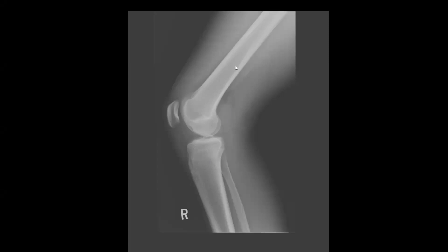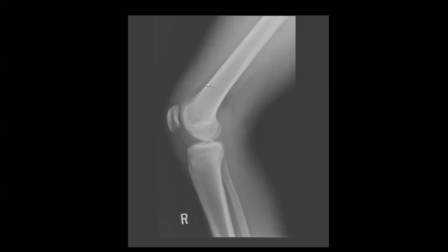If we take a look initially, we notice that there's no acute fracture or dislocation. The alignment of the knee looks intact. If you look at the relationship between the femur, the patella, and the tibia, everything looks great. There is, however, a small suprapatellar joint effusion. There's an increased density in this suprapatellar recess — it should normally look radiolucent, just like this pre-femoral fat pad. This whole area underneath the quadriceps tendon should be radiolucent, but we have this increased density here suggesting a suprapatellar effusion.